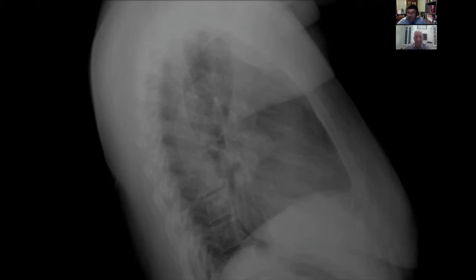Yeah, no, that's great. That's exactly what this is, Frank. That's a good call. So on the lateral view, I'm gonna outline this lobulated density here. This is what we kind of call potato lymph nodes, right? So a lot of things in radiology are named after food, but why do you think that is? But this is a very, very typical classic appearance for hilar lymphadenopathy.